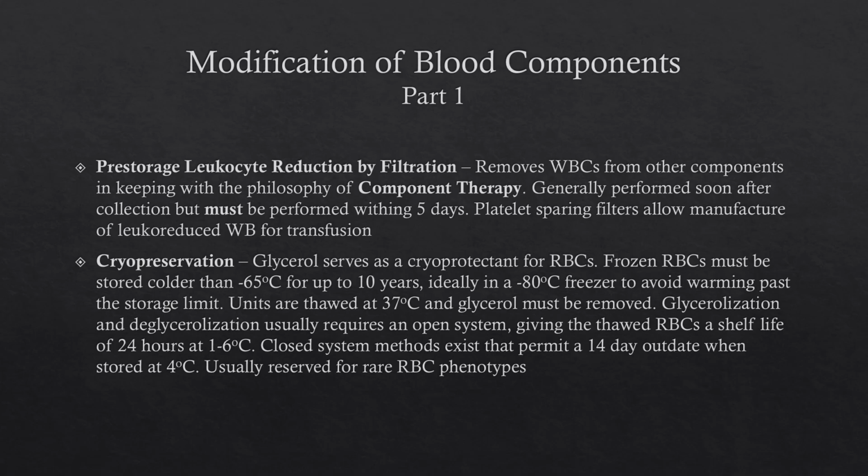This typically results in an open system. You have to spike the bag and add saline, things like that. So once we have an open system, the shelf life is reduced. Since it's a cold product, you get 24 hours while stored at 1 to 6 degrees Celsius. There are some methods that allow for a closed system to be maintained.